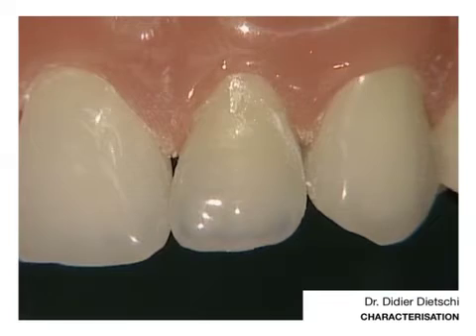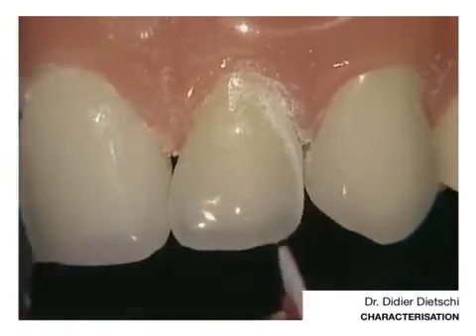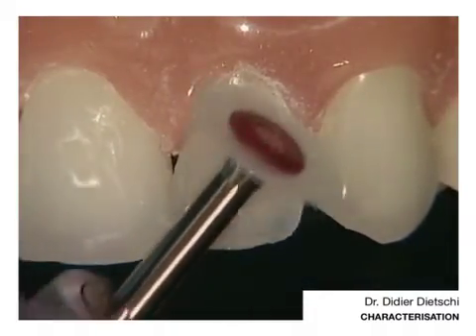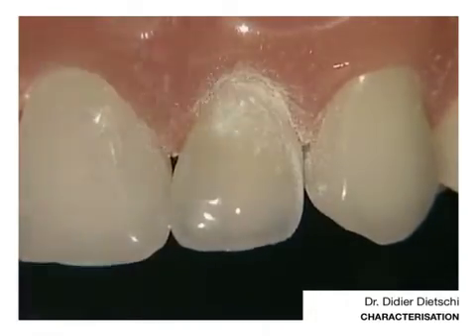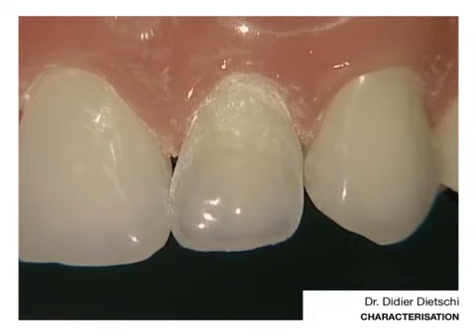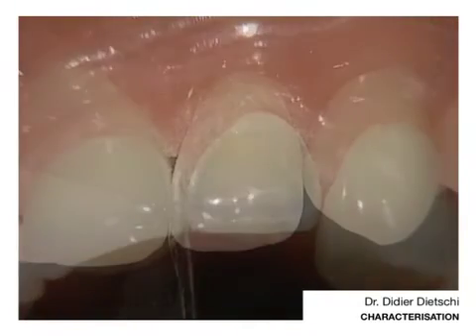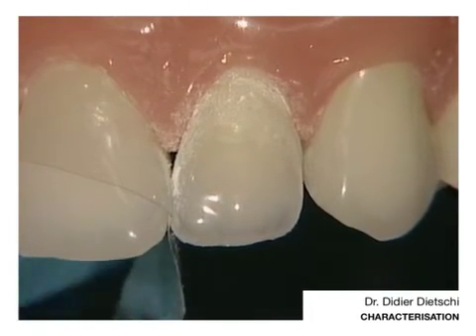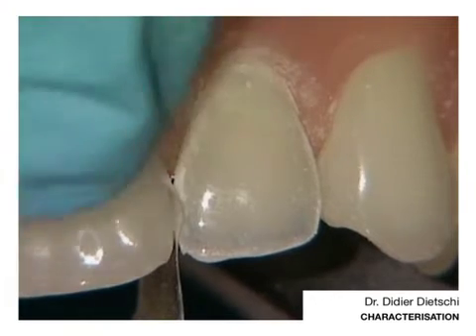Let's take a fresh instrument now, because this one is a little bit already used and worn down. I will be careful and place again the strip when I do that, so that I don't do anything which will eventually damage the surface of the other restoration. Repolishing.